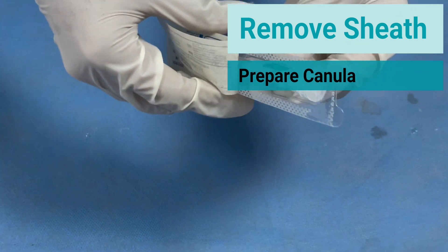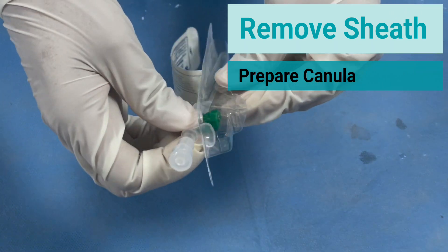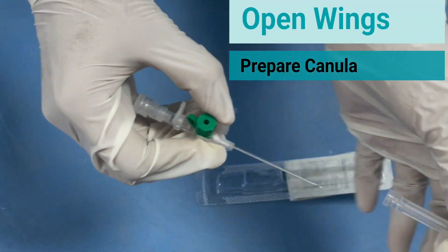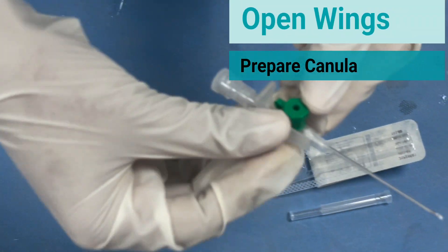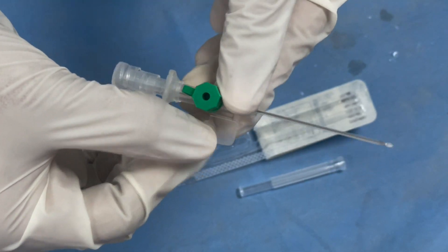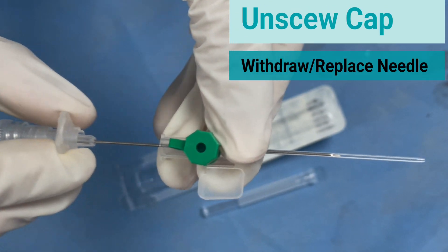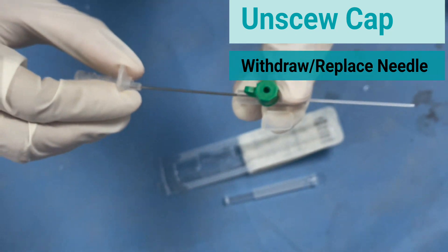Remove the sheath and prepare the cannula. Open the wings and keep it ready. Remove the cap. Withdraw and replace the needle.